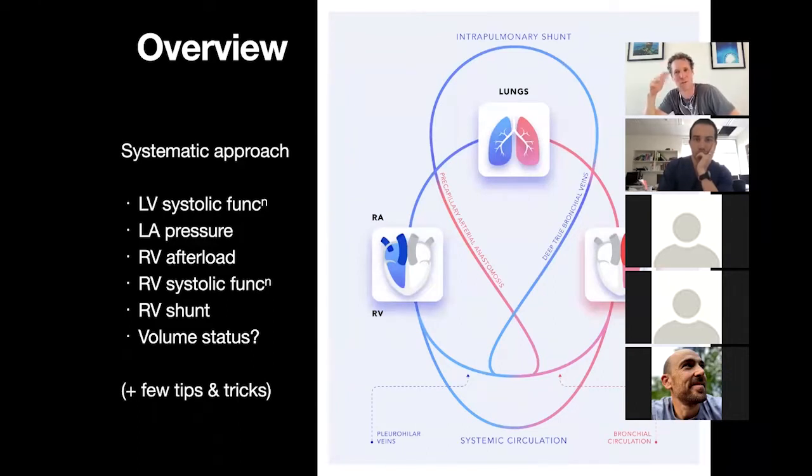for example, there was a tilt in the exam about someone with respiratory failure, intubated with LFT derangement, a lactic acidosis, and acute kidney injury, as in you've got someone with respiratory failure with potentially either a congestion issue from RV failure or a forward flow issue from LV failure. This is the kind of framework that you've got to try and get through pretty quickly for those written questions.